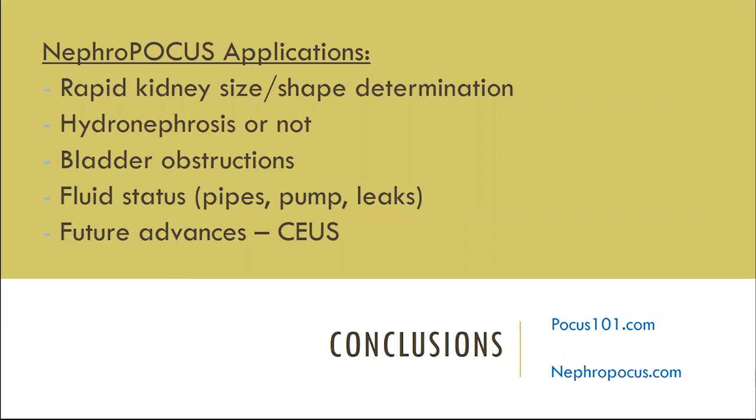I apologize, there was a question about using point-of-care ultrasound for suprapubic taps. I think that is certainly a reasonable one as well. I have never trained on that. It's not something I think done by most nephrologists, but certainly useful out there.